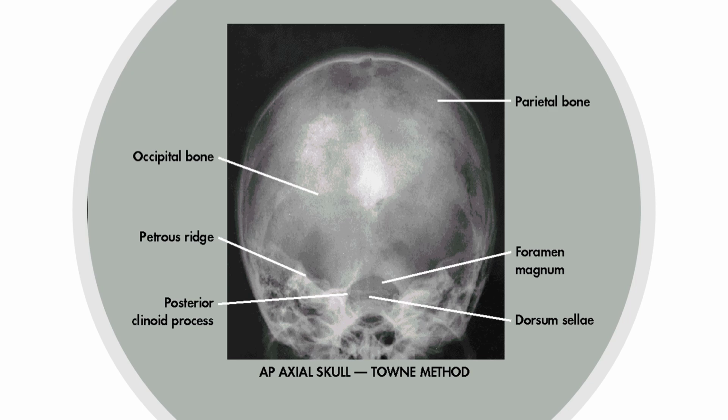Now you see the bright spot in the middle? That's where the occipital bone gets really thick. That is the superimposition of the external occipital protuberance, which is called the inion, and the internal occipital protuberance. So the occipital bone gets a thick bulge in the squamous portion, both on the external surface and the internal surface, roughly in about the same area.